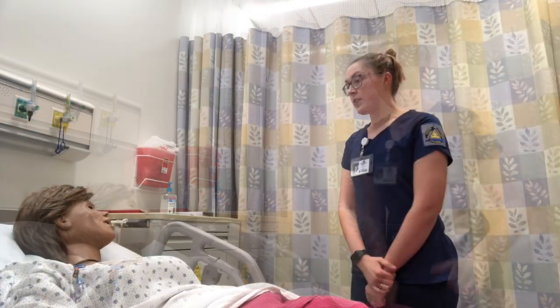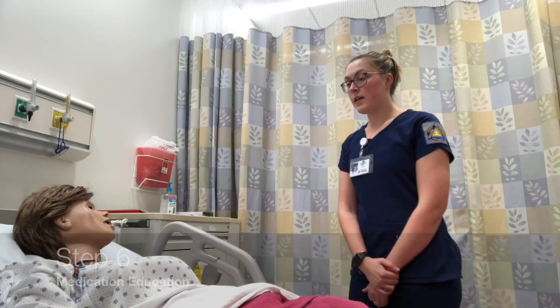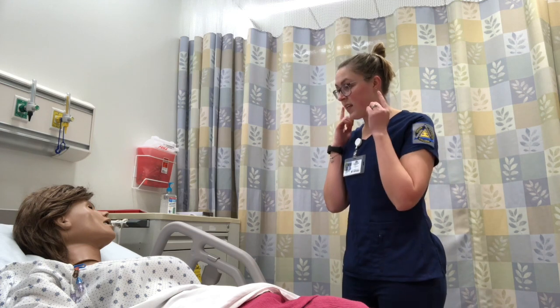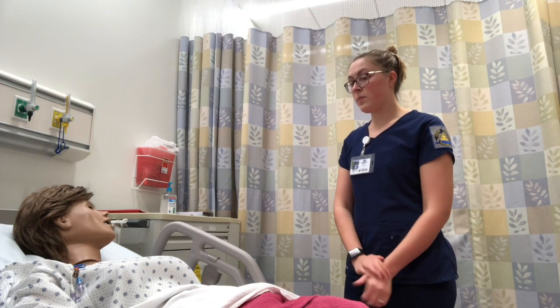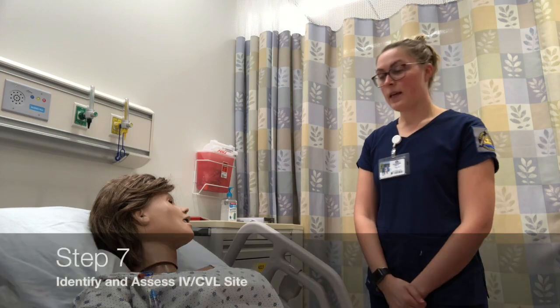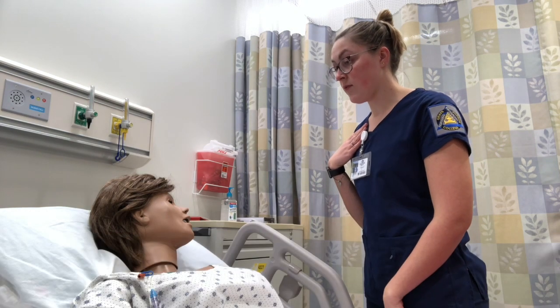Great. So today you're going to be receiving 30 milligrams IV Lasix or furosemide. It's for the edema that's in your legs. You might get some lightheadedness or tinnitus with this medication, which is ringing in your ears. So if you experience either of those, please let me know, and also push your call light if you need to get up out of the bed. Any questions? Okay.